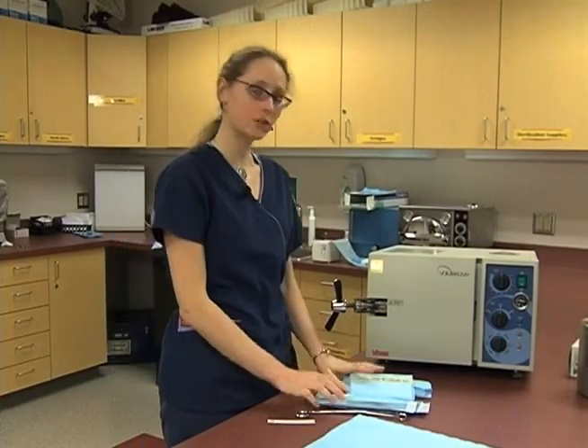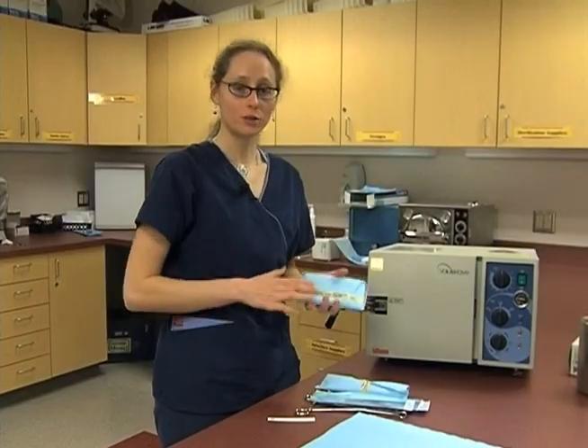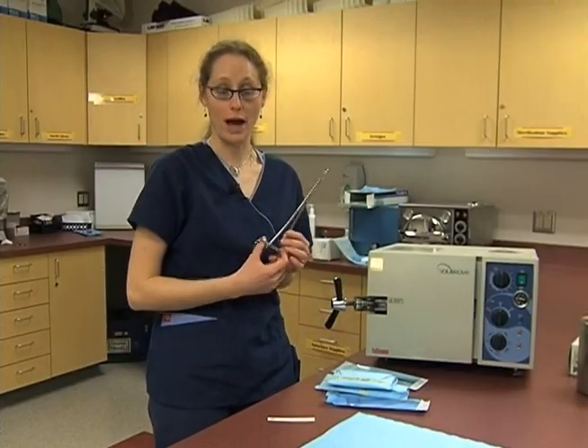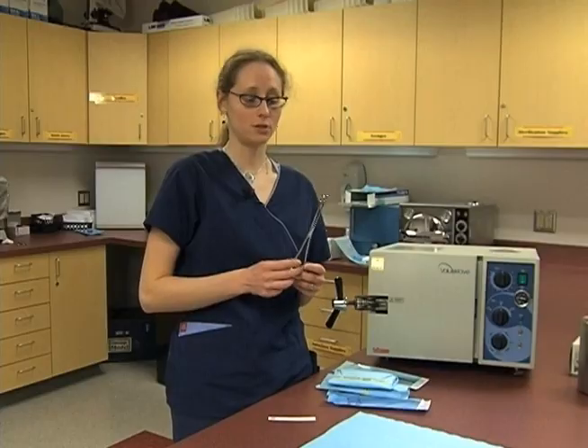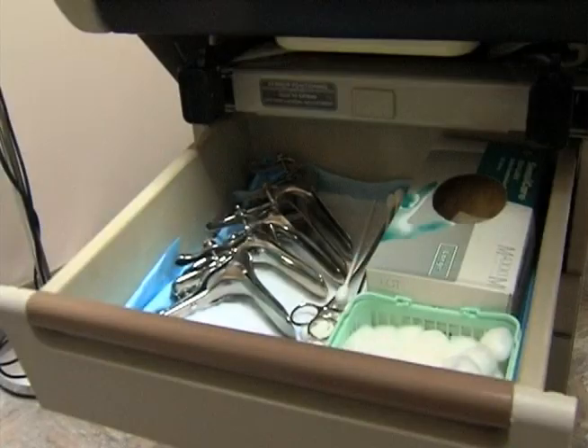When we're going to load our autoclave, now that we have all of our tools ready, we'll probably have a variety of tools — things that are wrapped, things in pouches, and items that don't need to be wrapped or put into a pouch. Some objects are used for non-sterile procedures but need to be very well cleaned, so they will be sanitized and dried, then put in the autoclave to be fully cleaned, and stored in a clean drawer until they're used.